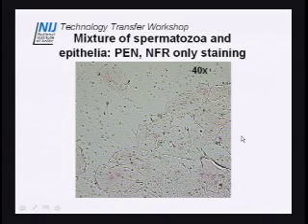How long do you stain with this? With this, it's only 2 to 3 minutes that I put the stain on. I can't remember what Christine does. What did you do normally for a differential? Did you only stain for 2 to 3 minutes normally? No, we did like 15 to 20 minutes, 15 for the nuclear fast red, so that would be reduced. Yeah, which is nice. It's much quicker. You only need a 2 to 3 minute stain. But still, look, you can see that it's picking up the red in even just the 2 minutes that you're staining. So anyway, that's what this depiction is.